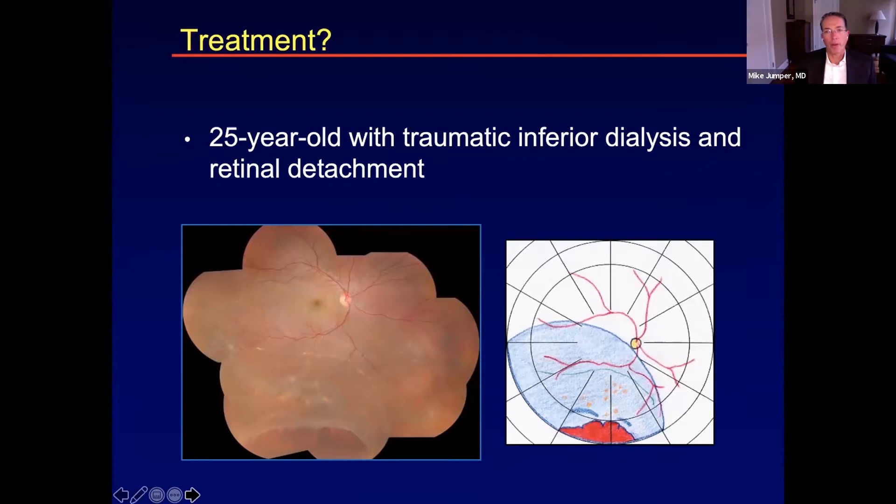One of the things to discuss with fellows is where the vitreous is attached versus detached. The vitreous is attached to the posterior edge of a dialysis break, as opposed to a giant tear or horseshoe tear case where it's attached to the anterior flap. Most of the time with a dialysis, a buckle is a much easier surgery because the vitreous is attached. The challenge is that the buckle sometimes has to be placed quite anteriorly near the ora serrata. The subretinal band is a consideration — you need to judge which bands will cause problems and which won't. This is one of those bands that can be easily buckled.